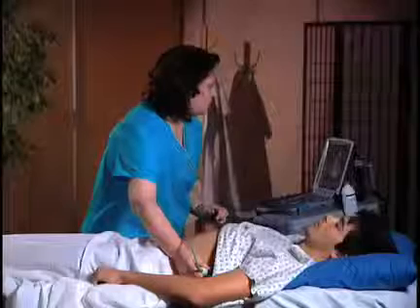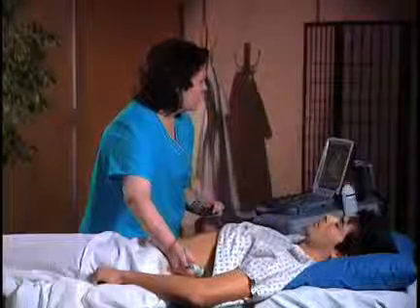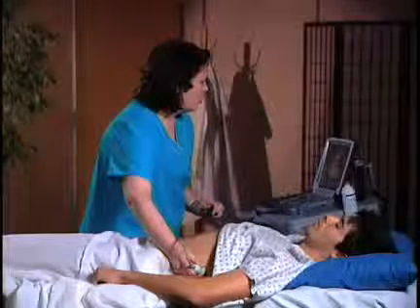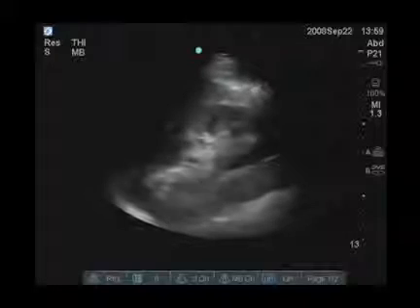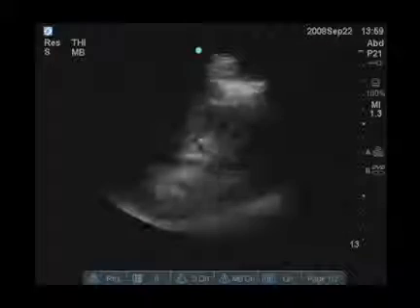Then I'm going to move down one rib space, evaluate the lower pole of the kidney, and sweep medial to lateral to make sure I've looked at all of the tissue, because these stones can be quite small, so you have to do a very thorough evaluation.